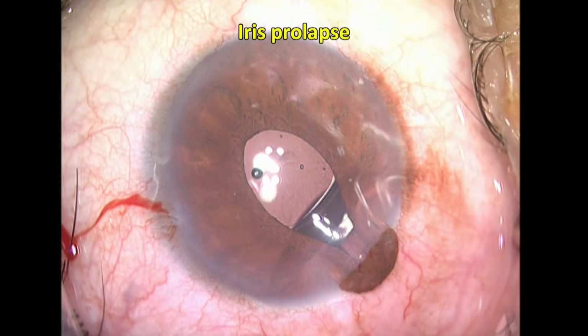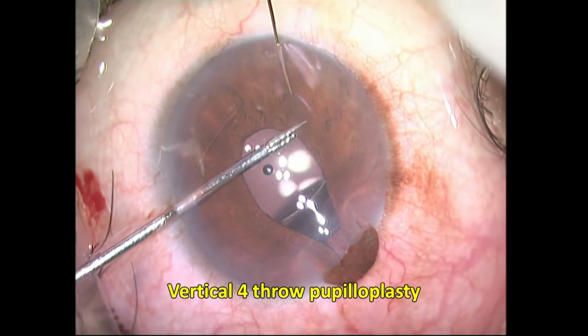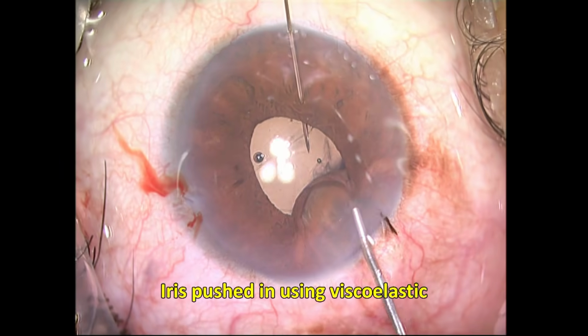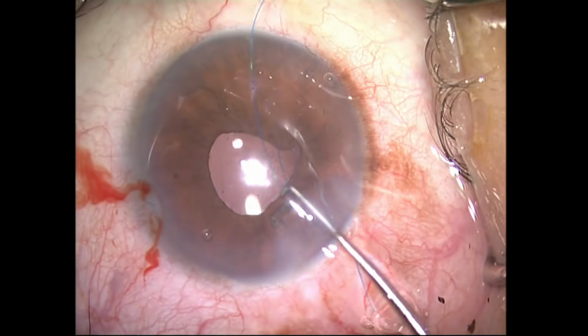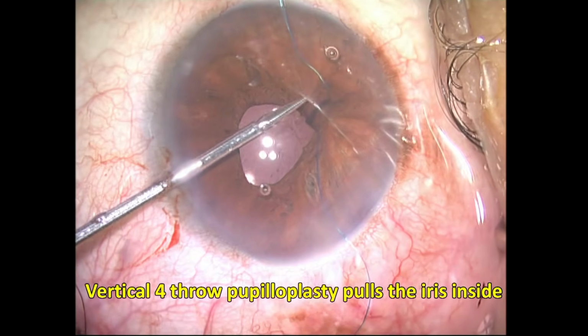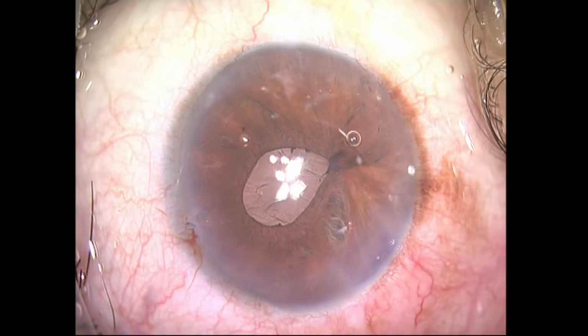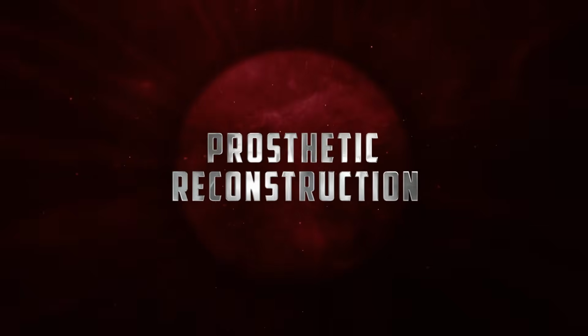This video shows a massive floppy iris and performing a vertical SFT in this case causes withdrawal of the iris from the corneal incisions and places it centrally. Now, a vertical iris repair in this patient engages the iris tissue and makes it taut and prevents its prolapse into the corneal incision. Prosthetic reconstruction.